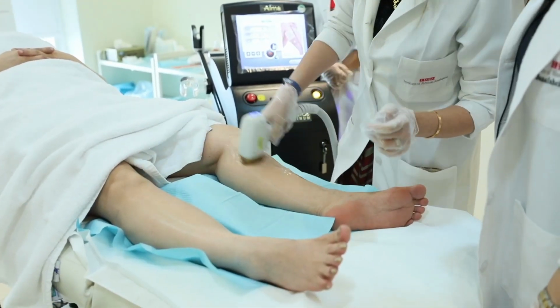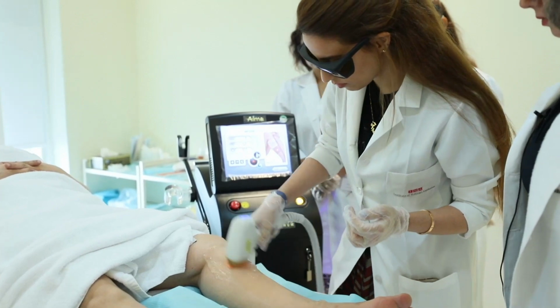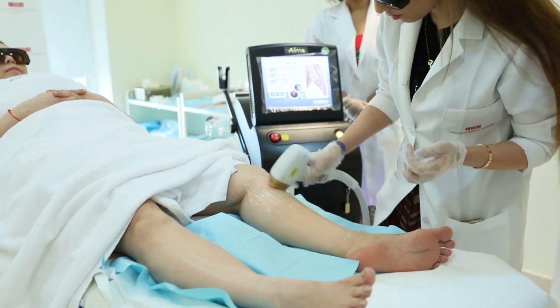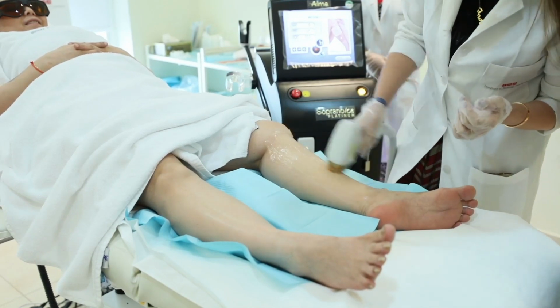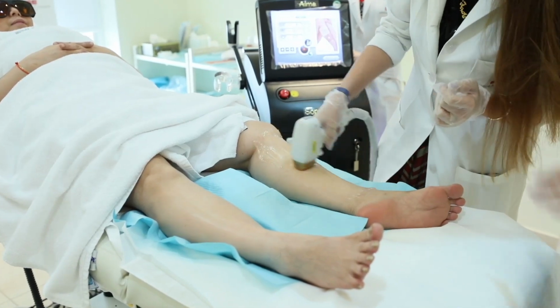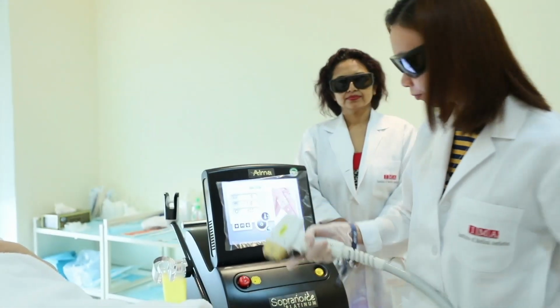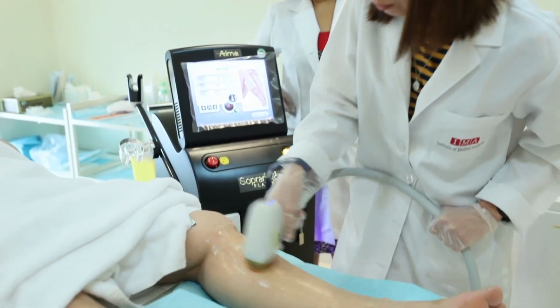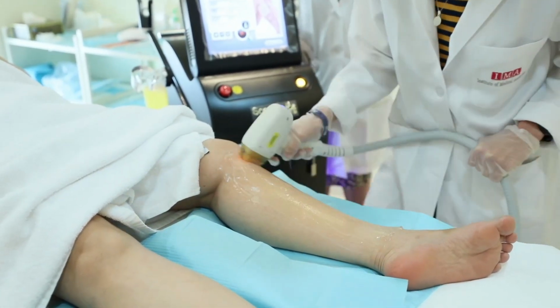Exactly. Exactly. Very good. Are you comfortable? Done already, and then start. Very good.